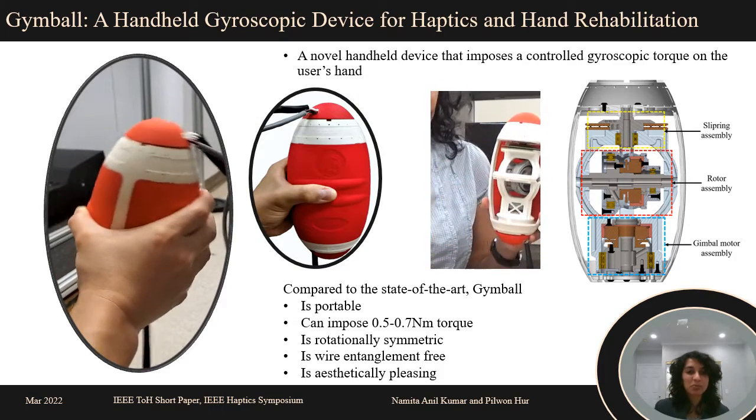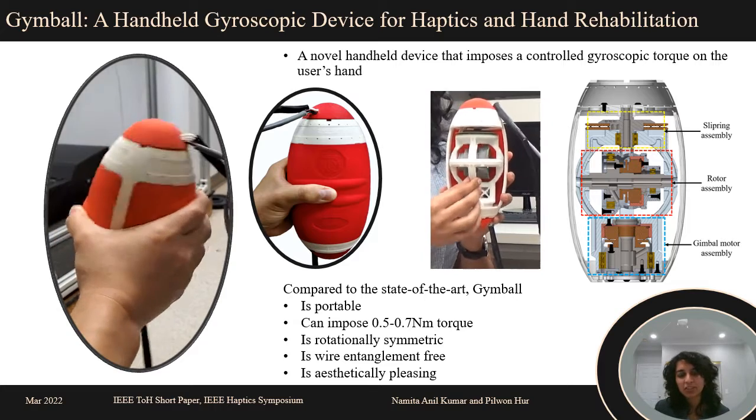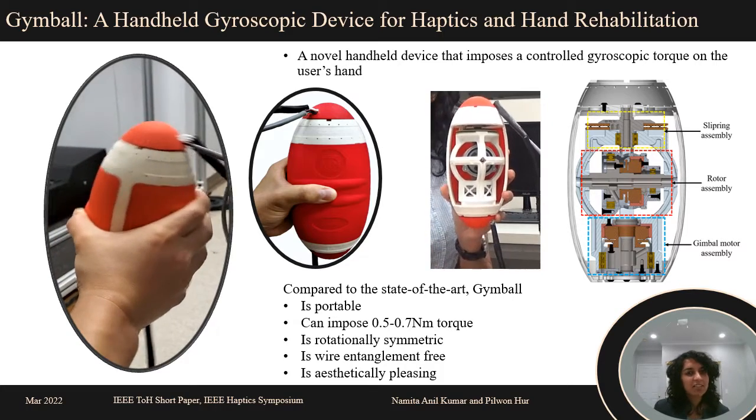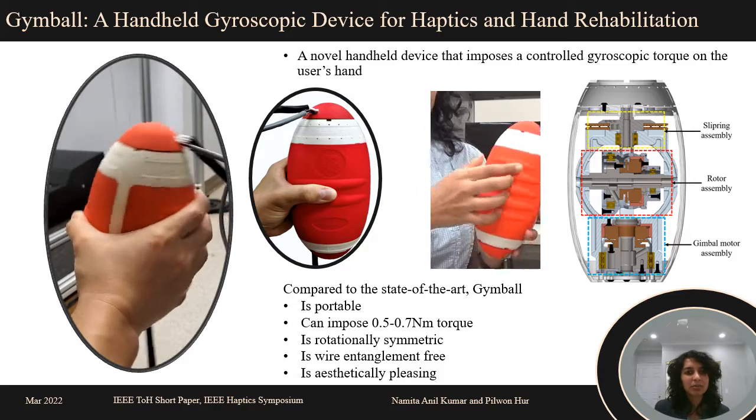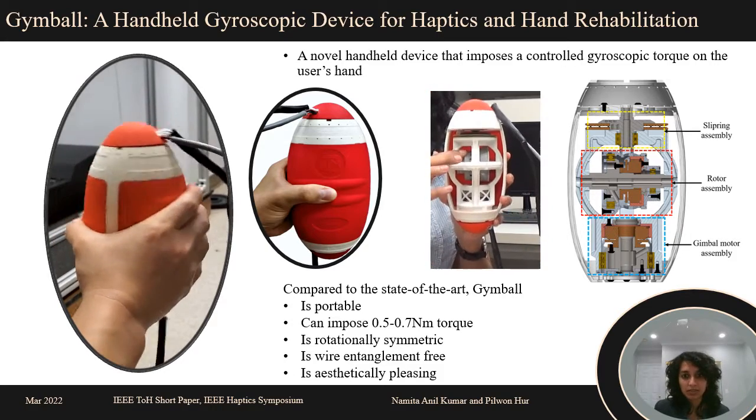We present to you Gymball, a handheld gyroscopic device for haptics and hand rehabilitation. It consists of a fully-actuated rotor and gimbal assembly, and it can impose a controlled torque about the user's wrist.